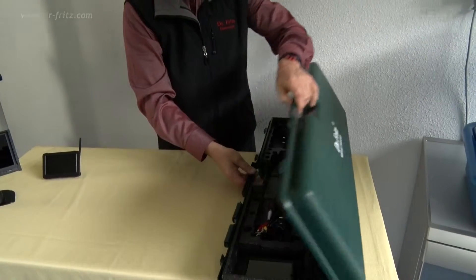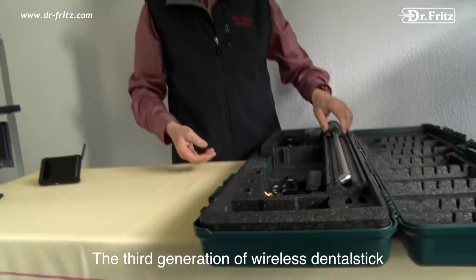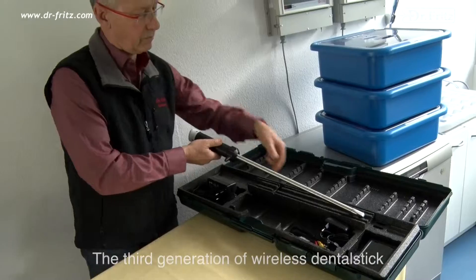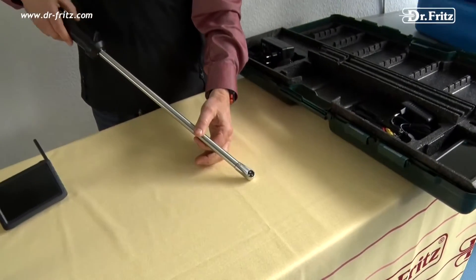The third generation of Dr. Fritz Dental Stick is completely wireless. The LEDs and the integrated lithium battery guarantee wireless video transmission for about 80 minutes.